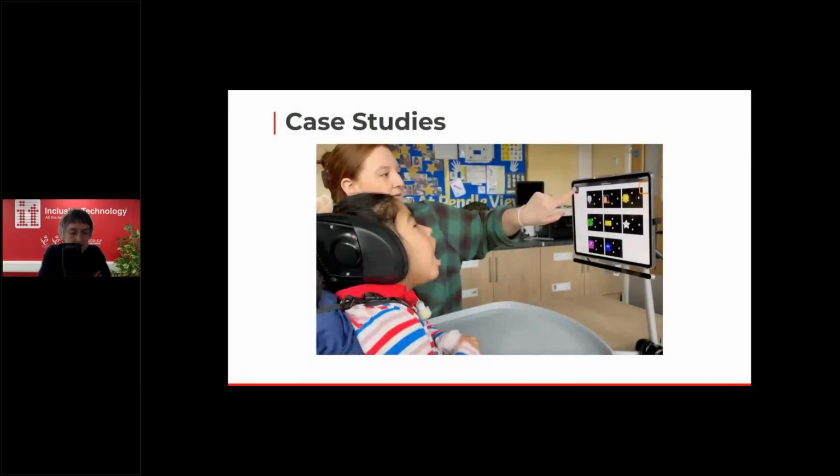Again, just a few final words from the teacher about Aliza there. Aliza actually tires easily, so using an eye tracker that is quick to set up, as well as the Insight program, is really helpful. As a result, we can carry out short yet effective activities with her, tracking progress, which really supports planning and the development of targets. So that was Aliza.